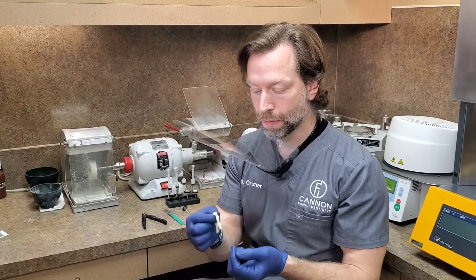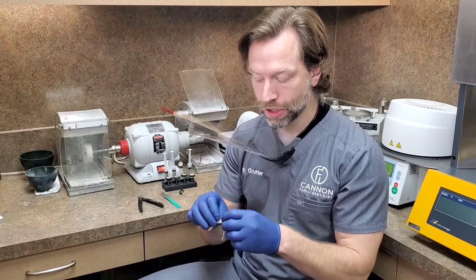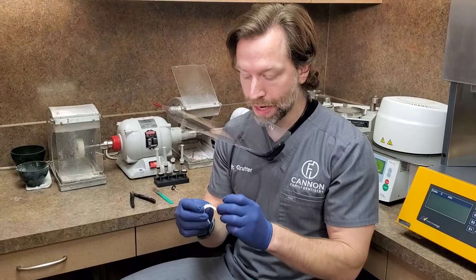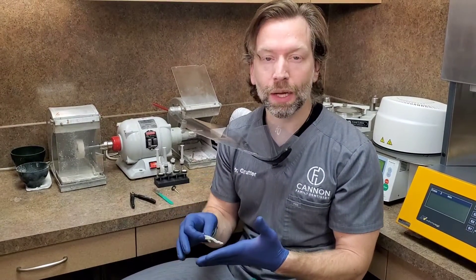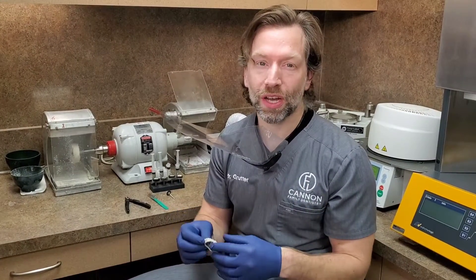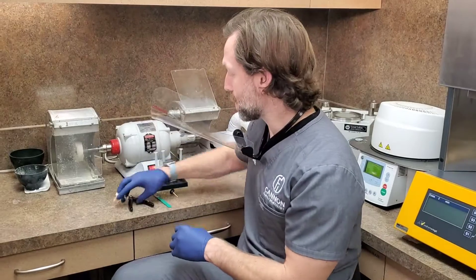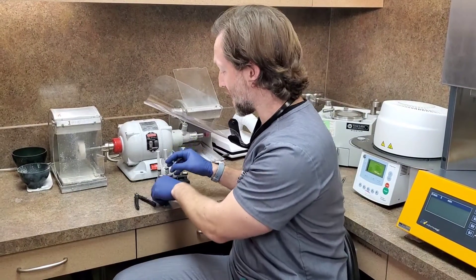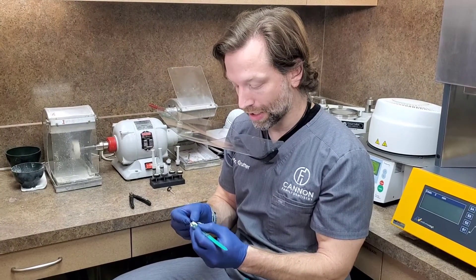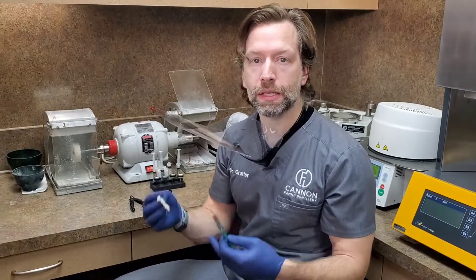I'm aware of this because of polishing — throwing some diamond paste stuff at myself. So this is the flipper after curing. I actually had the supports on the bottom — I like that because it's less polishing where the patient's going to feel it with their tongue. You might have a little dimple you want to get so it's not pressing the gums, but a lot of times small things are noticed with the tongue even when the gum tissue doesn't care. If you need anything adjusted, either use nips to clip it off, or you can use a blade and shave off some little pieces — I find that works almost as well or better than a handpiece, just cleaner and easier.